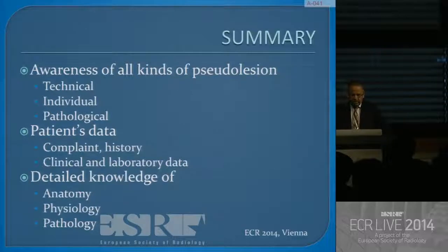Awareness of all kinds of pseudolesion, either technical, individual, or pathological, with the knowledge of the patient's data, complaint, history, clinical and laboratory data, with the detailed knowledge of anatomy, physiology, and pathology is the main way to overcome this kind of pseudolesions.